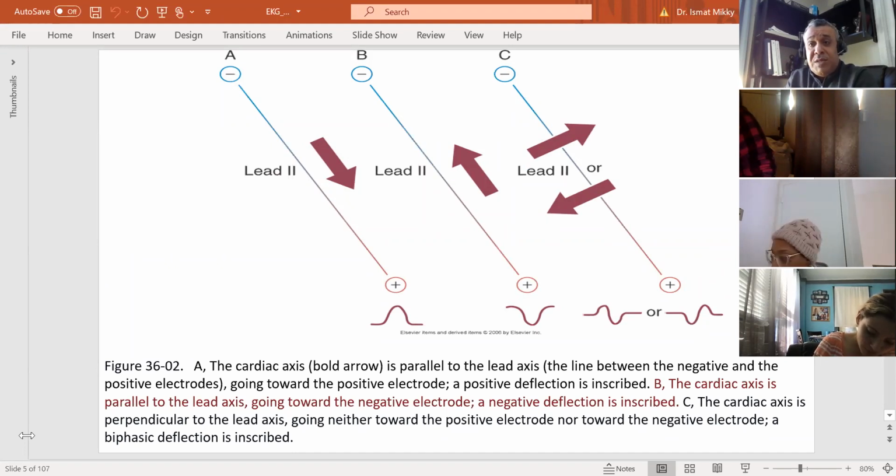There are specific changes on the EKG strip that you can use to identify these electrolyte imbalances, especially hypokalemia and hyperkalemia. With hyperkalemia, for example, patients will have a tall, peaked T wave. We'll go over that when we get to the interpretation of the EKG.